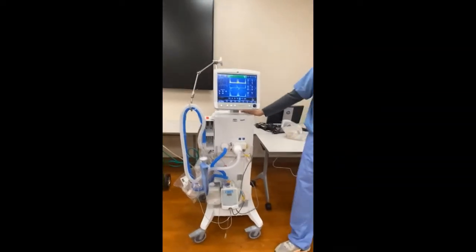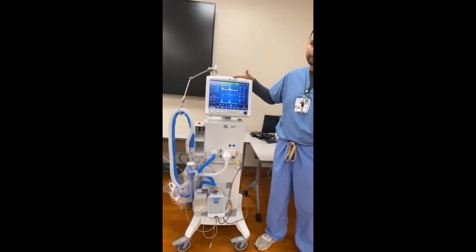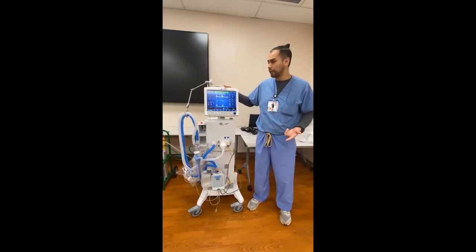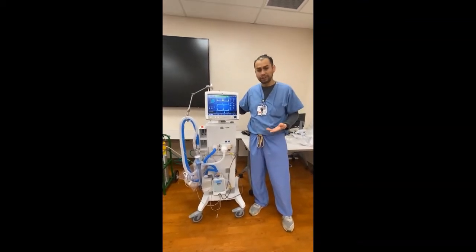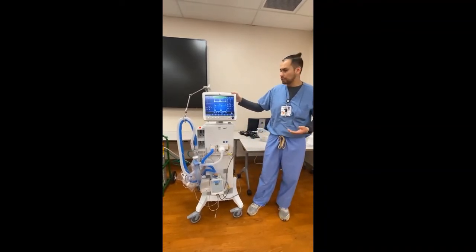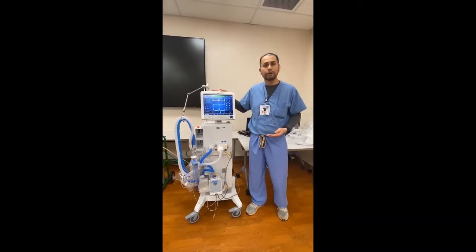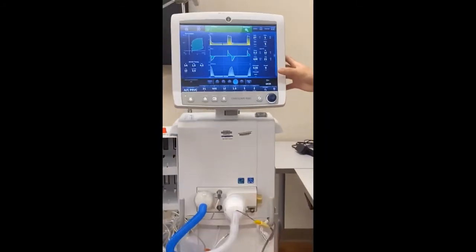Now we have our ventilator. The ventilator will be our last resort, if the BiPAP is not helping, they're not meeting oxygen needs, or they're unstable on the BiPAP and still remain tachypneic, greater than 35 breaths per minute or so, with intercostal breathing and abdominal retractions. This is something where we want to take over for the patient and actually help breathe for them. Okay, so we have a couple of things that I'll be discussing here.